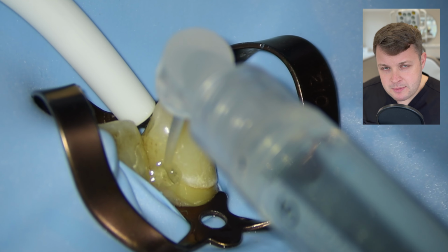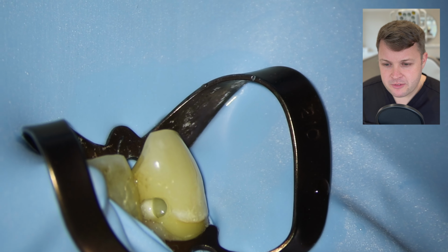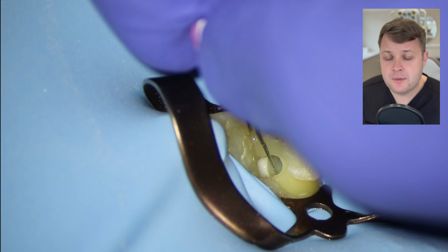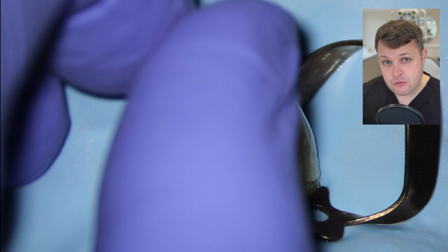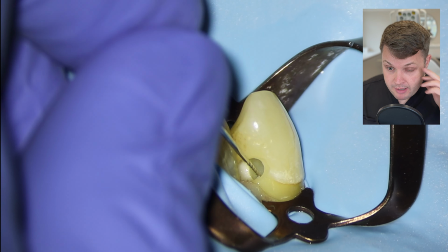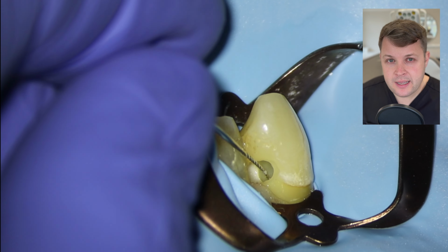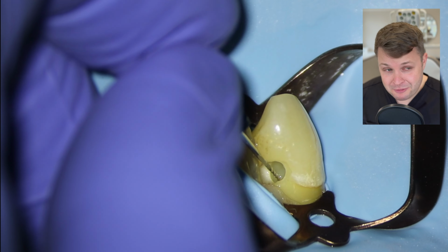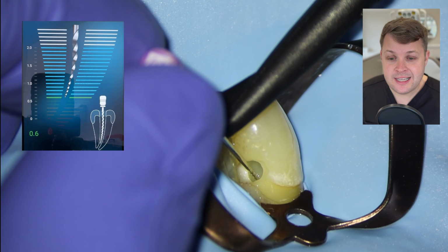And I'm thinking to myself, should I not access this tooth at this point? And I think to myself, I really do want to try and preserve as much dentin, as much tooth tissue as possible. So I'm going to get my size 10 K file, and you'll notice that I'm using an extra long K file here. This is about 31 millimeters, and I'm having a little watch wind around through this mesial hole, and I notice that I'm getting significant resistance from this file, and I'm thinking to myself, is this a bad idea? I feel like I've wedded myself to the idea of doing an access cavity here, but in the back of my mind, I'm always thinking, is this a good idea or not?